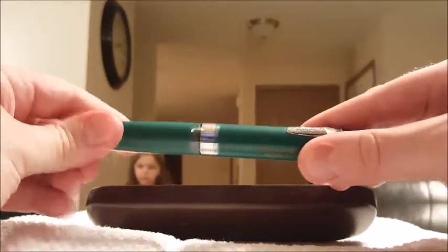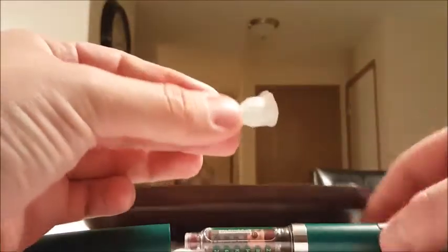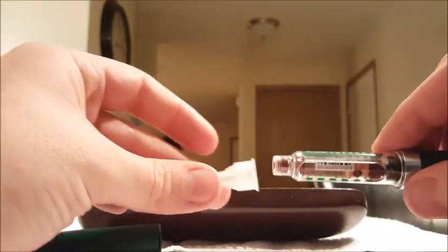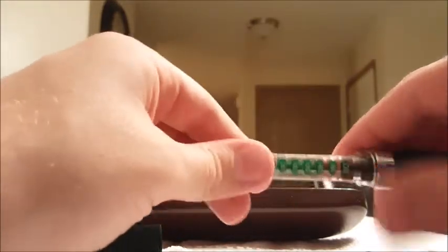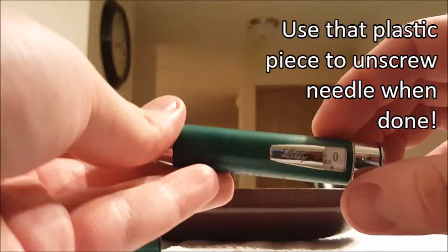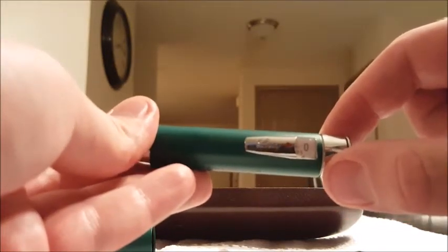Take the cap off. Take one of these needles and take the paper off. Then you simply screw on the needle. Take off the plastic piece and you turn this knob to the number of units that she needs.